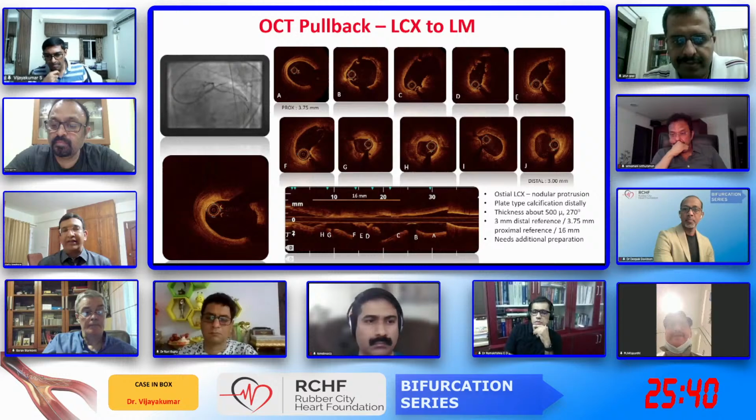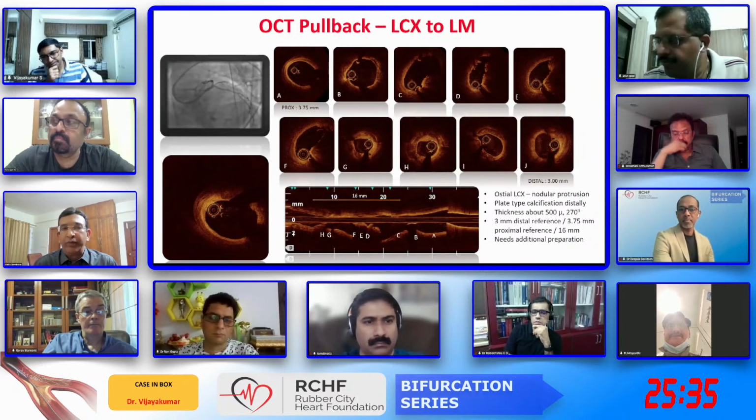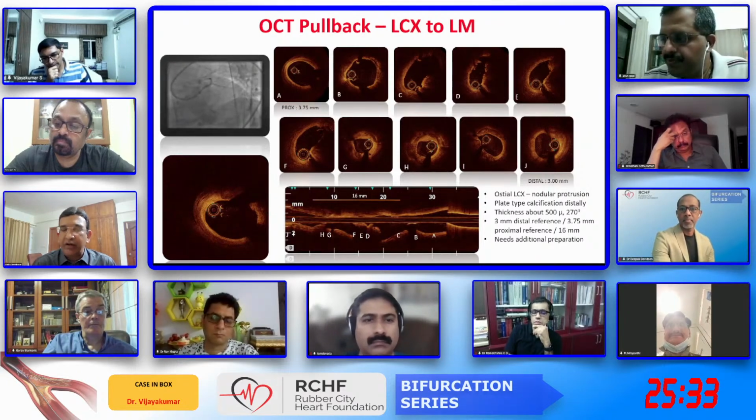Can I just ask a question? Here, because the distal circumflex is well open, you don't need an IVL. All you need is for a nodule. For a nodule, would you really need an IVL?